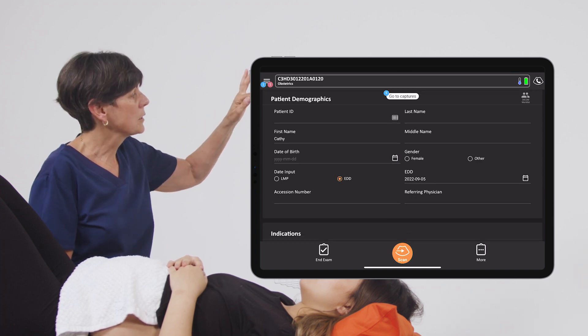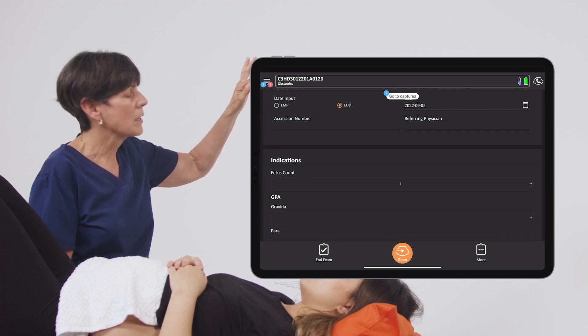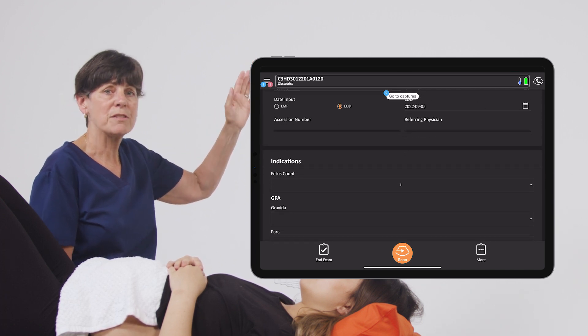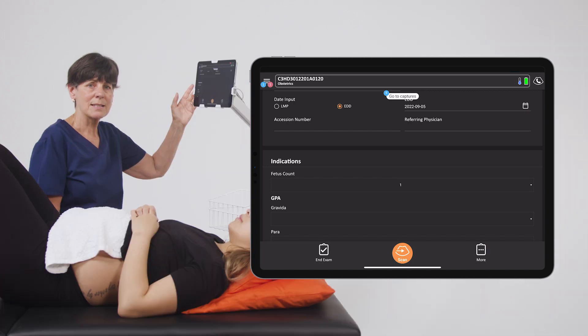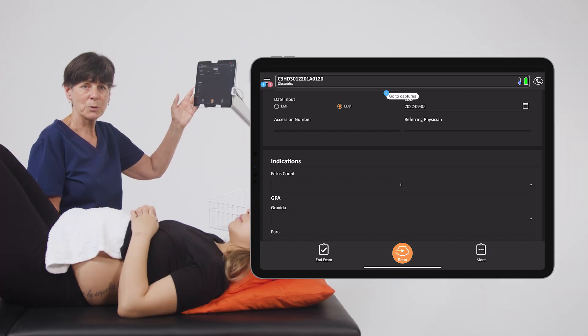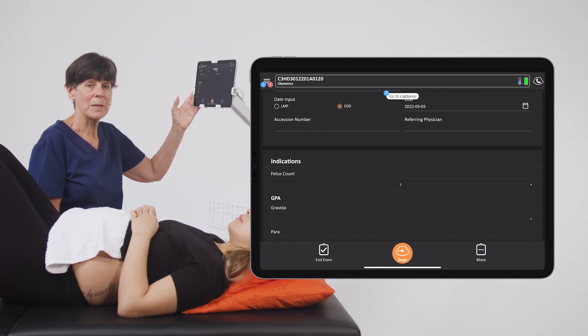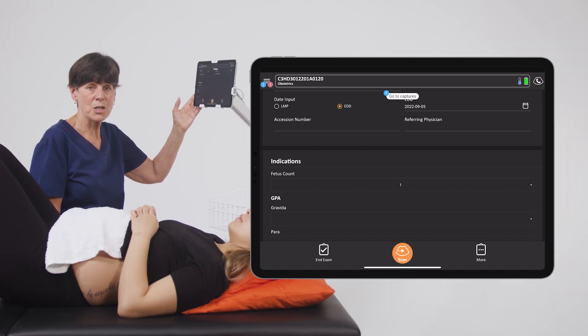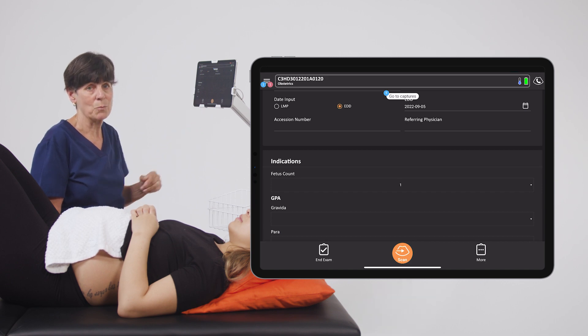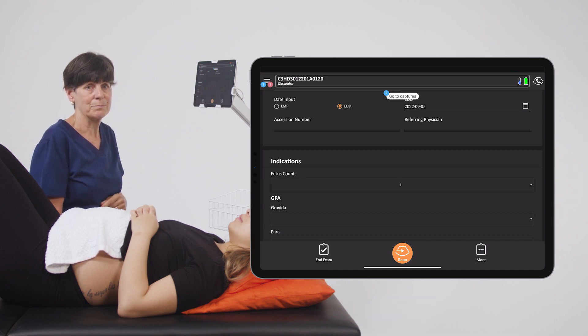Now if you scroll down a little bit more, there's another new feature that lets us indicate multiple gestations up to five, making biometry measurements much easier and more organized with multiples.